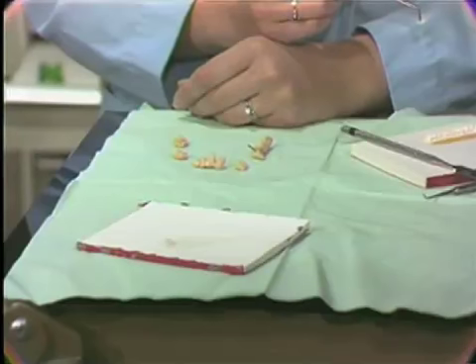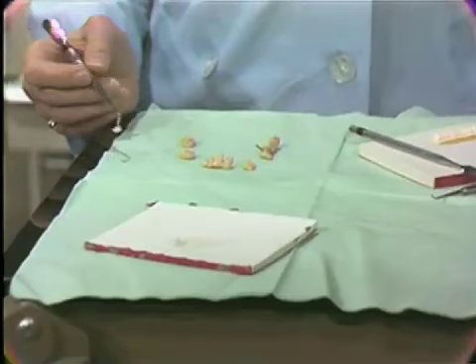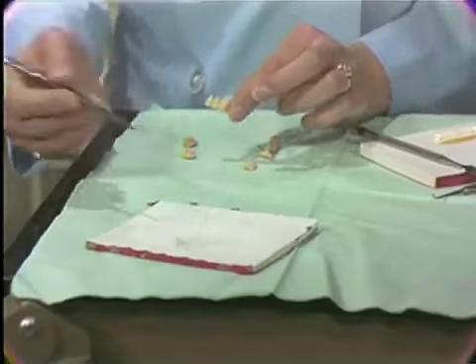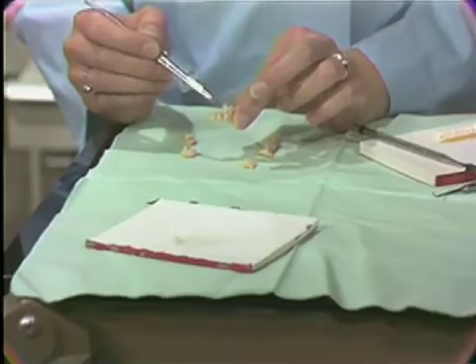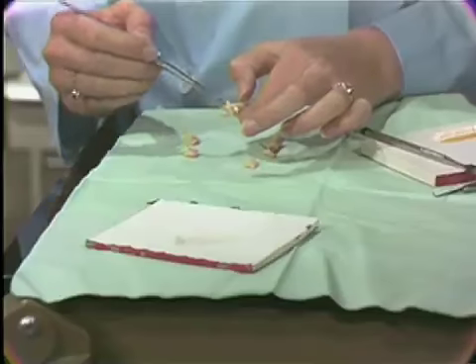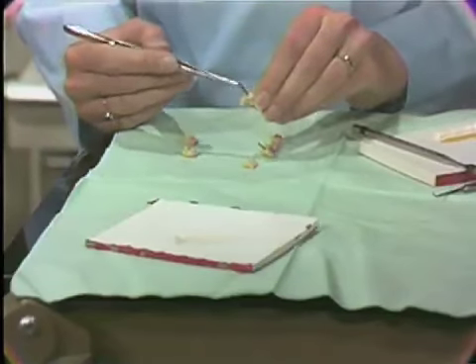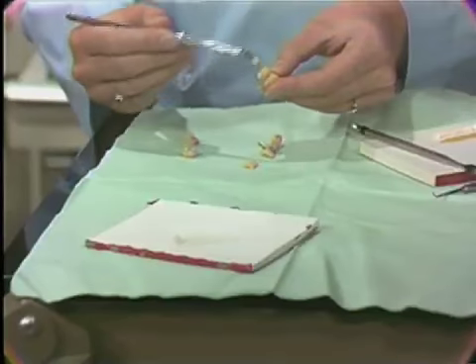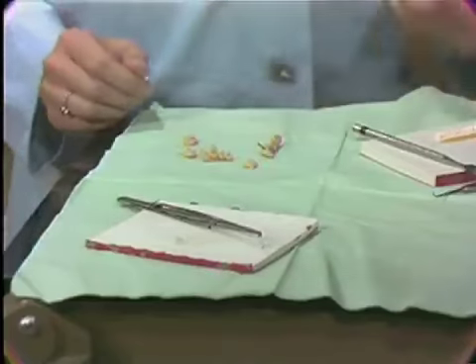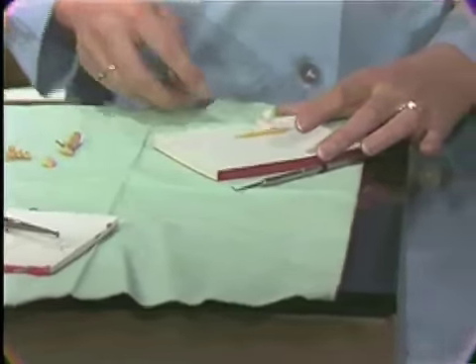The temporaries can be cleaned off nicely in the mouth if they are coated with a lubricant. So take the temporary and, using a little lubricant such as Vaseline or silicate cement lubricant, cover all the axial surfaces of the acrylic. We're going to cement these in place with Temp Bond, which gives us about 1,000 pounds of strength. And we want to be able to clean this off of the temporary after we get it cemented in place.